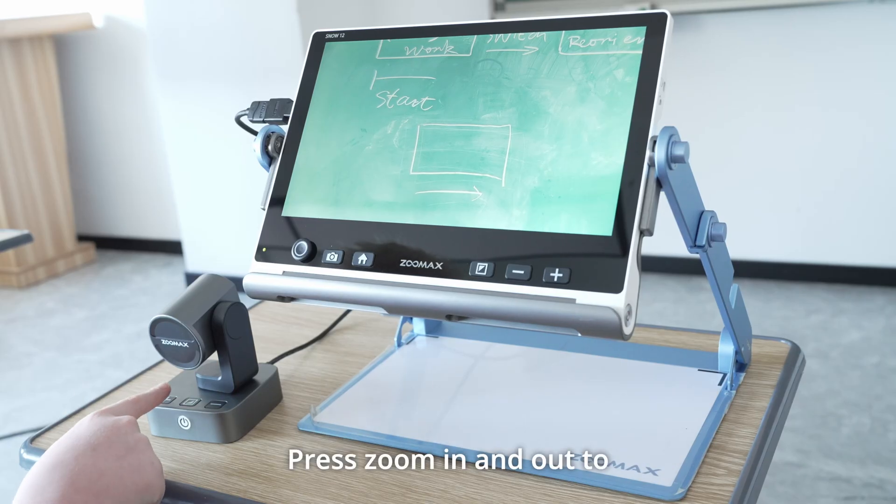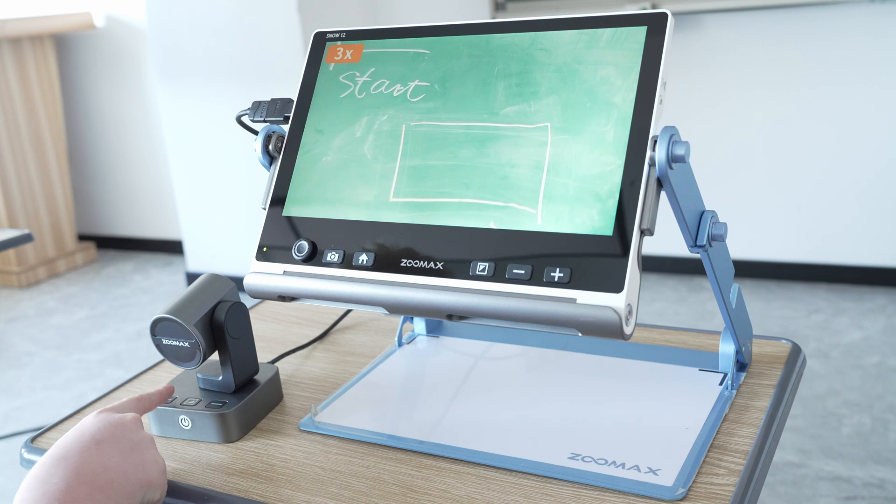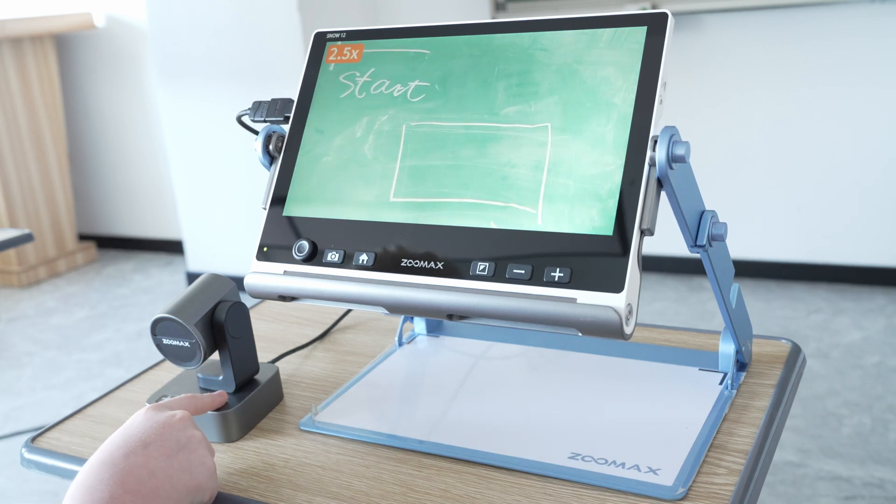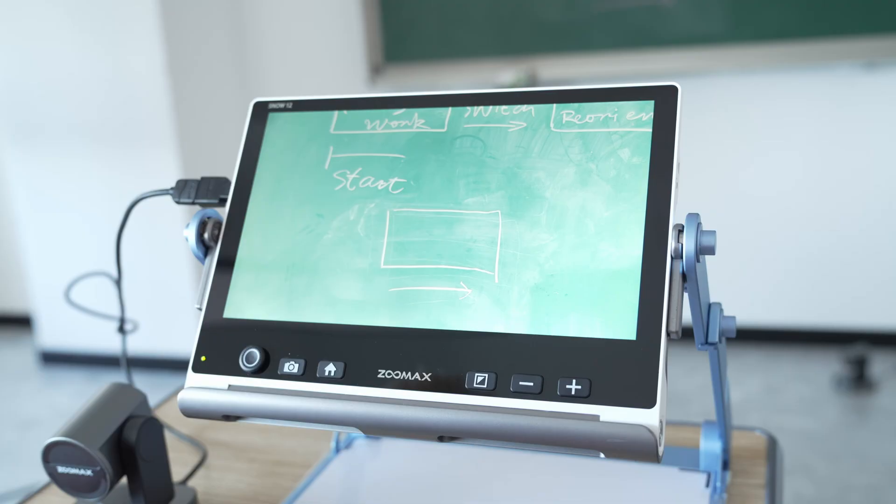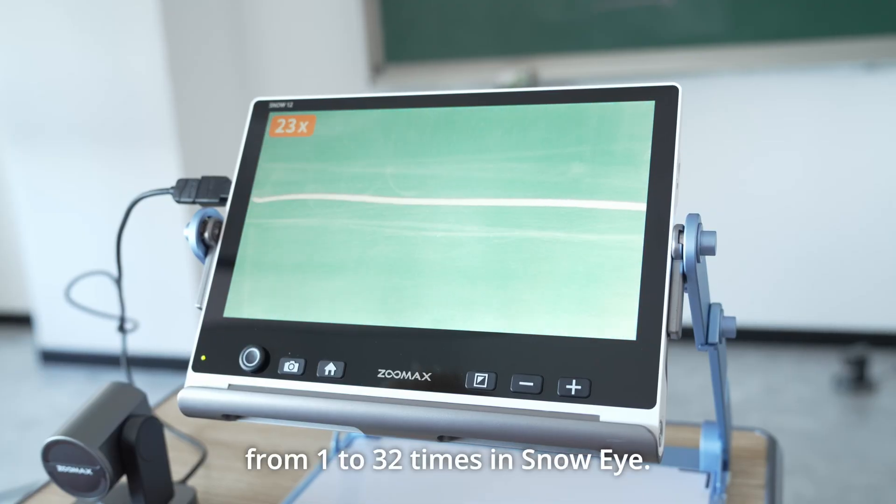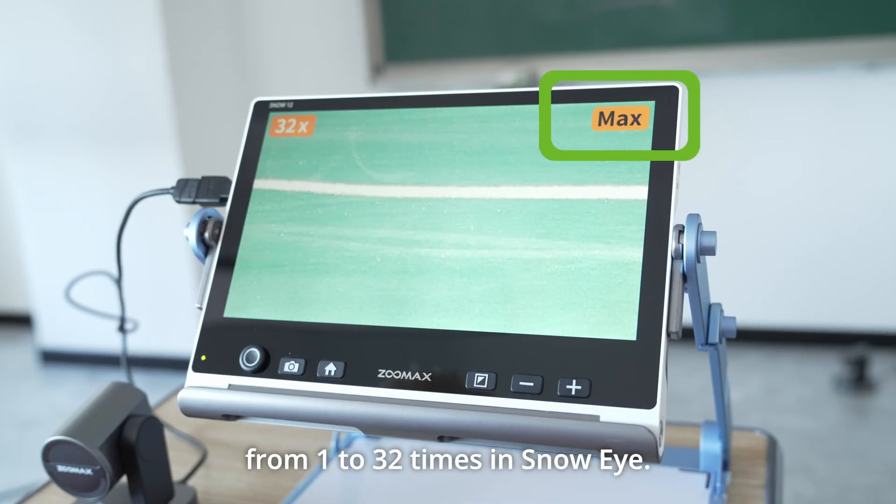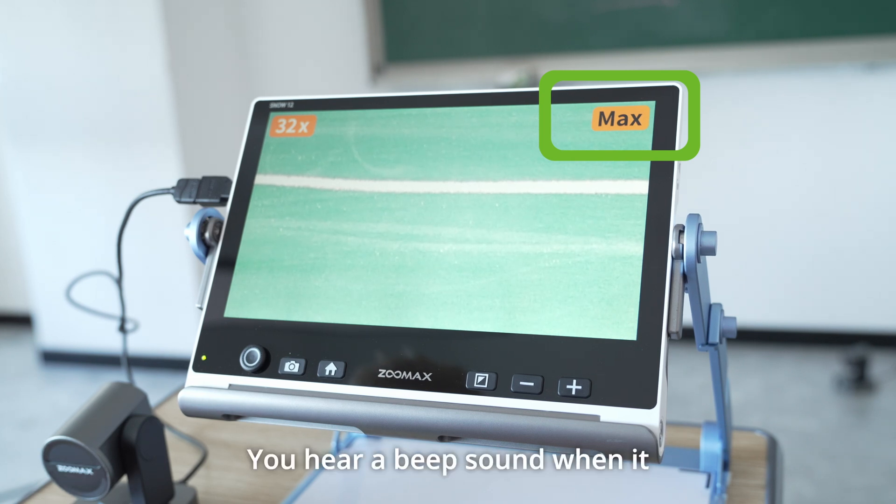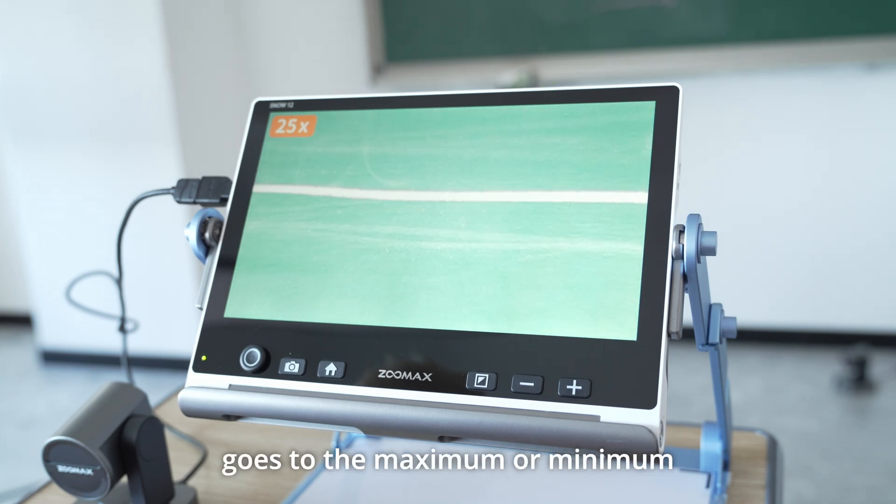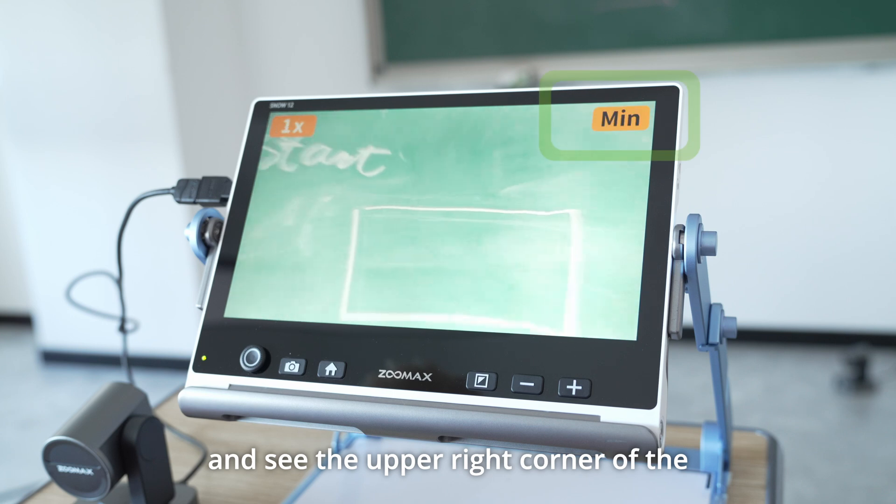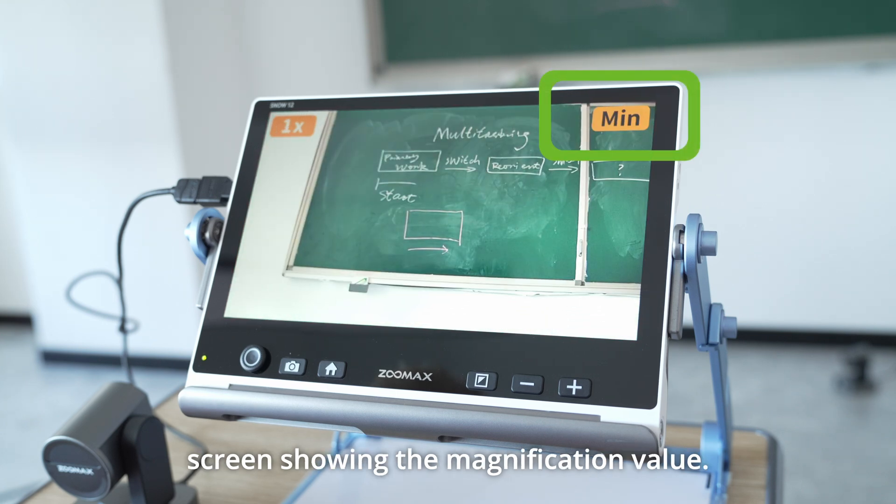Press zoom in and out to get a favorite magnification. The magnification range is from 1 to 32 times in Snow Eye. You hear a beep sound when it goes to the maximum or minimum and see the upper right corner of the screen showing the magnification value.